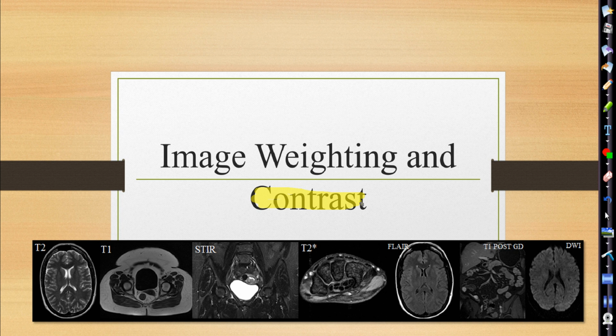So MRI is really no different when we're talking about image contrast, because we're really just talking about the different shades of gray or black or white, right? So we're able to differentiate one structure from another. That really gives us our contrast. When we're talking about weighting next lecture, it's really how we adjust those parameters, what we call our extrinsic parameters, on our MRI console to get a desired image weighting so that we can rule out certain things, like different pathologies.